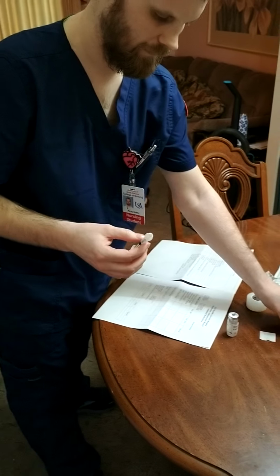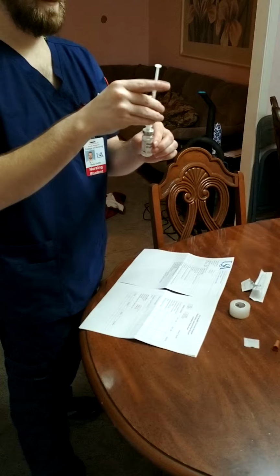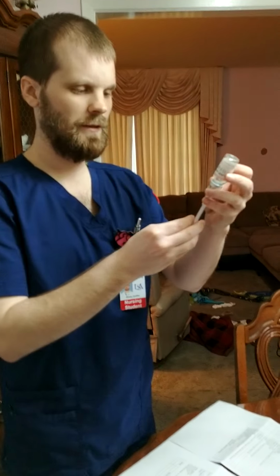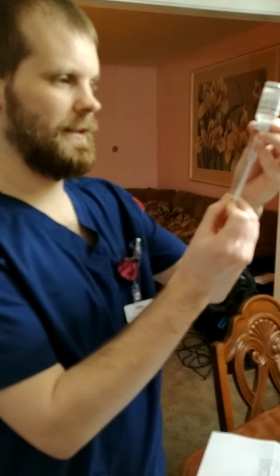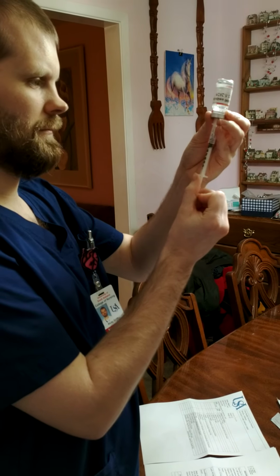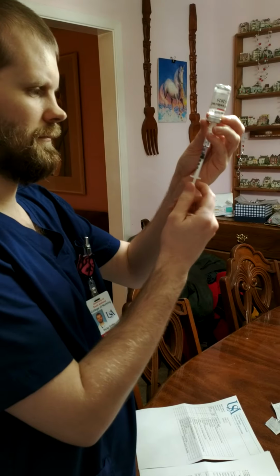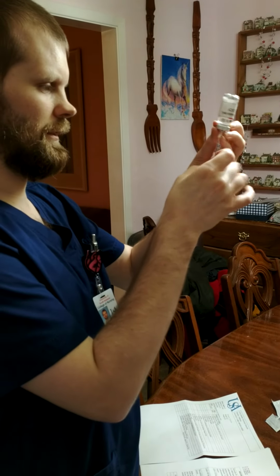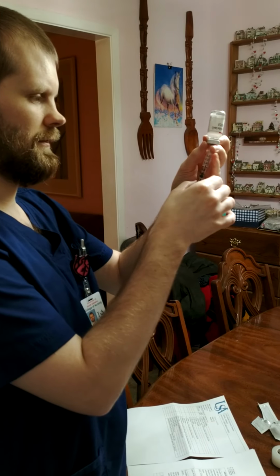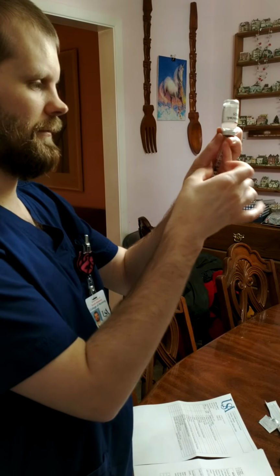Here's the cap. Inject the air. And then draw out my medication. And I will remove any air bubbles to ensure that I have the correct amount of medication.